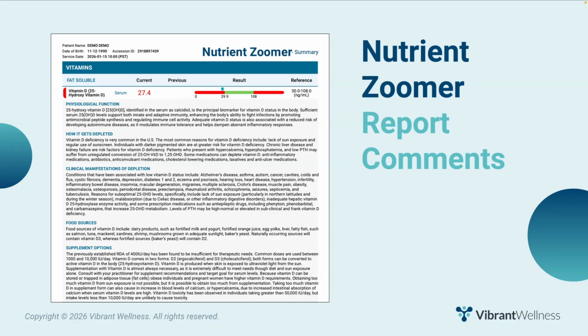These 7 risk scores are informed by the out-of-range nutrients. The list of out-of-range markers appear at the end of the report along with report comments. The report comments for out-of-range markers include the physiological function of the nutrient, how it gets depleted, clinical manifestations of depletion, food sources, and supplement options.